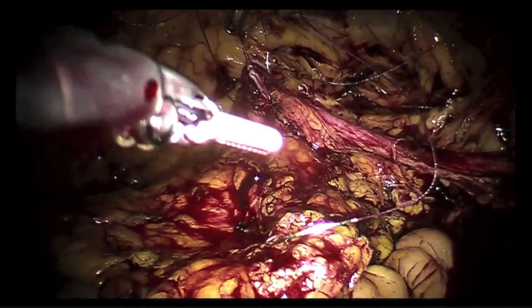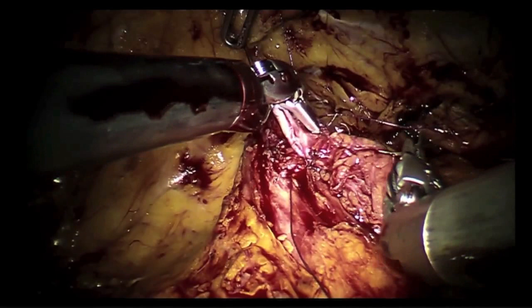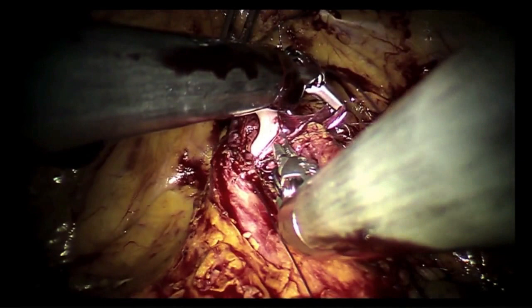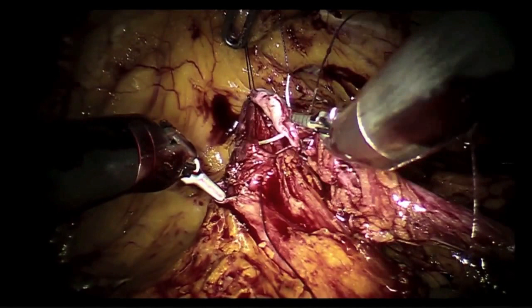Okay, so now we're just putting in the ureter. So we can talk about anything you want to talk about. I mean, it is key. Dr. Gill, what do you think about the... Go ahead. So what do you think about the learning curve of this operation?